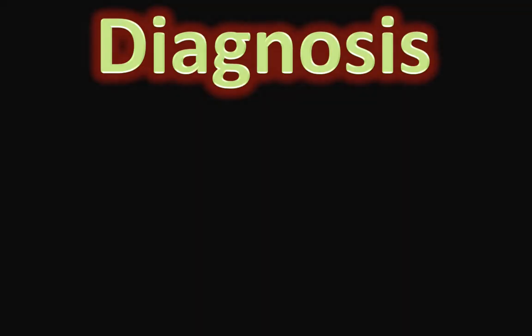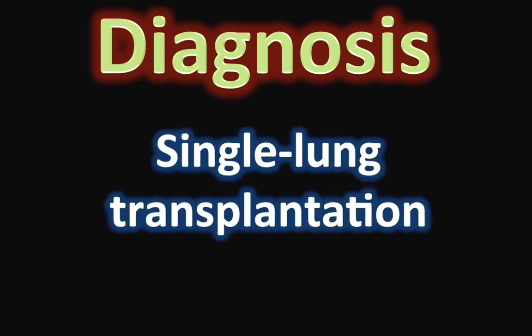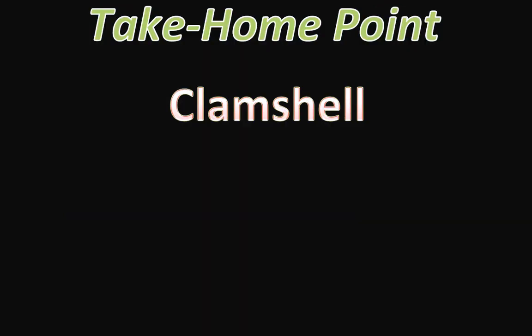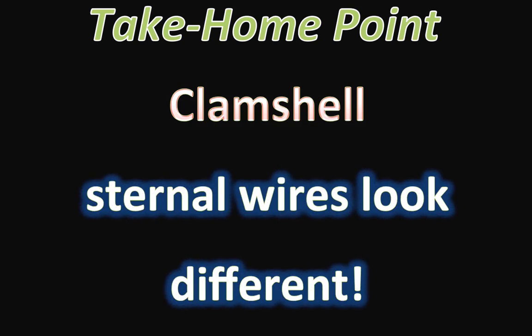So the diagnosis is single left-sided lung transplantation for chronic fibrotic lung disease. The take-home point is that clamshell wires have a different appearance compared to the classic post-CABG wires, and if you see them it's almost always a case of lung transplantation.